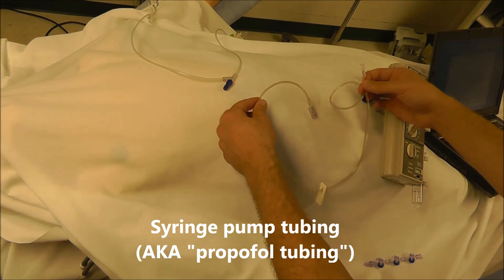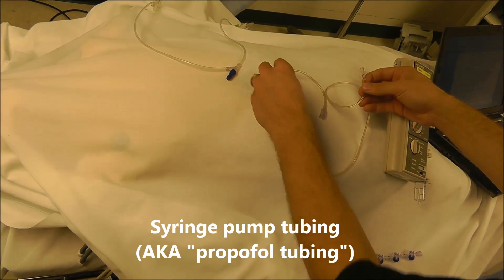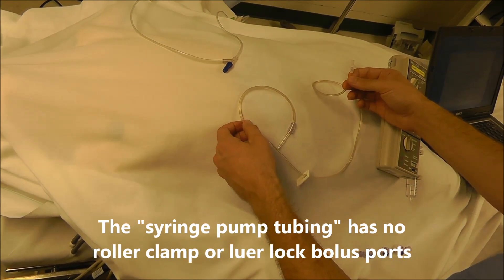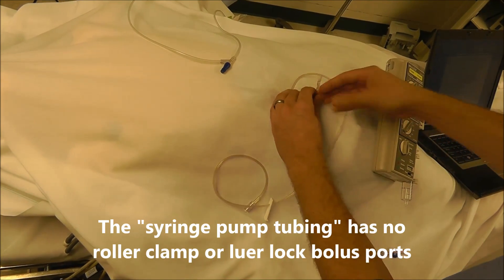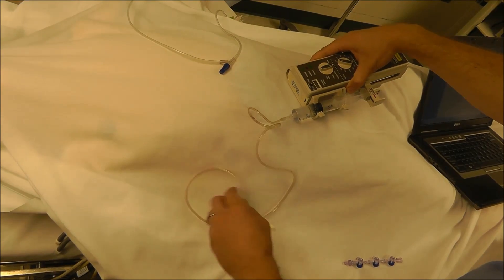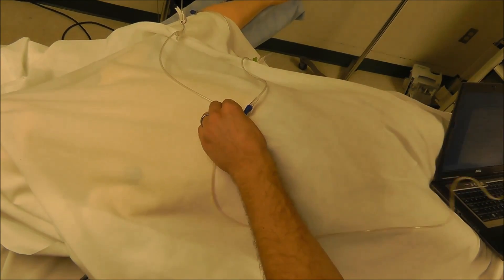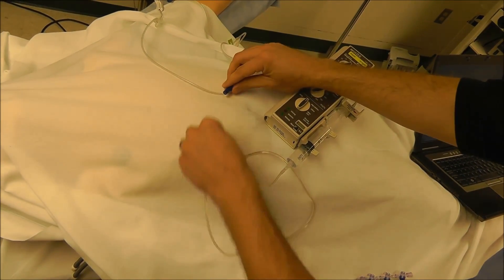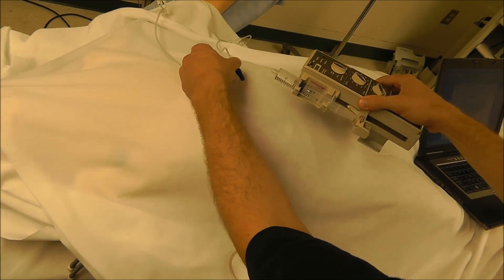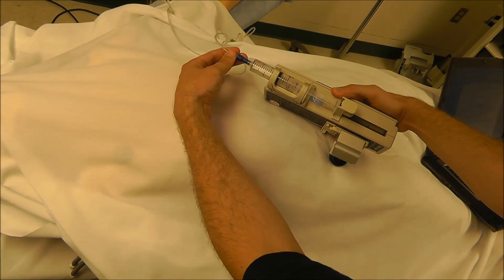The next type of tubing is extension tubing without a roller clamp or any bolus ports — this is syringe pump tubing, and in many cases it's non-compliant. We call this propofol tubing. It allows you to connect your syringe pump to the main line in a piggyback fashion from a distance. Without this syringe pump tubing, you would have to connect the syringe pump very close to the line and it wouldn't be able to reach from a distance.